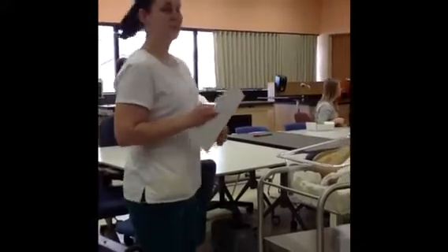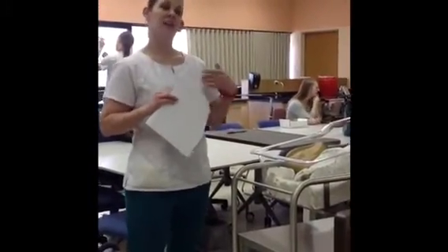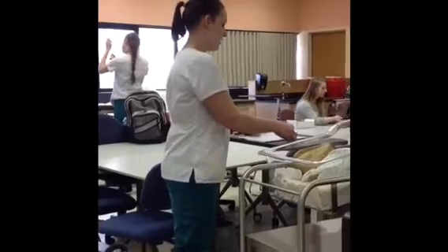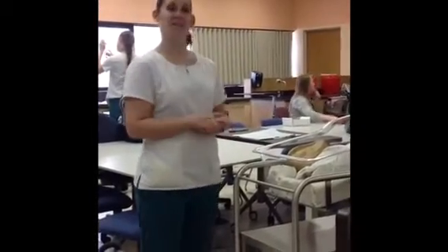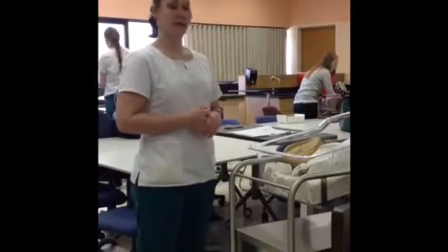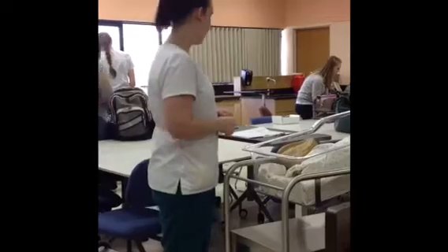Okay, so now I'm ready to administer the vaccination to the baby. So I'm going to come into the patient's room. I would knock. I'm going to identify myself. My name is Sharon. I'm a student nurse with HCC. I would be speaking to the parents. I would tell them I'm here with the hepatitis B vaccine, which we already have the signed consent for, so that's all set. I would ask them if they would like to be present while I give the injection so they can comfort the baby, anything like that.